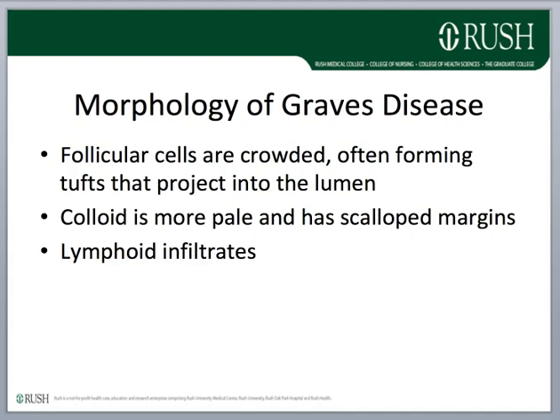Okay, next let's look at Graves' disease. Grossly, the thyroid is usually diffusely and symmetrically enlarged due to diffuse hypertrophy and hyperplasia of the thyroid follicular epithelial cells, which we'll see in a section. So the cut surface is actually an exaggeration of the normal thyroid parenchyma. It has a soft meaty appearance that resembles, in some respects, skeletal muscle.